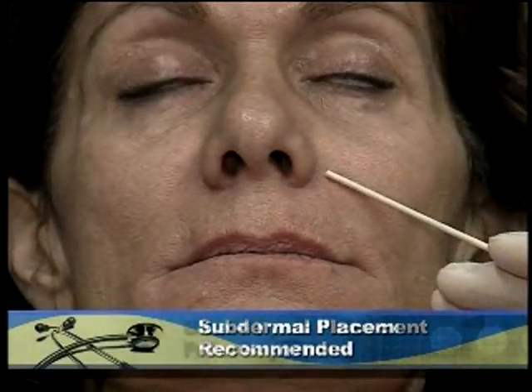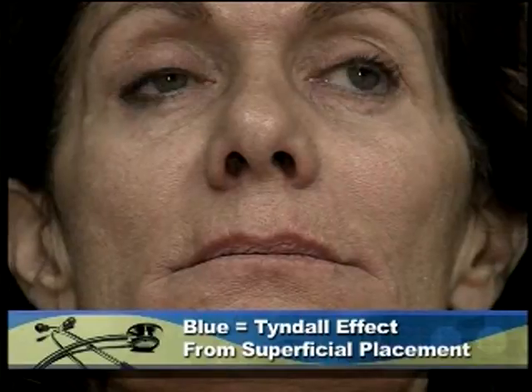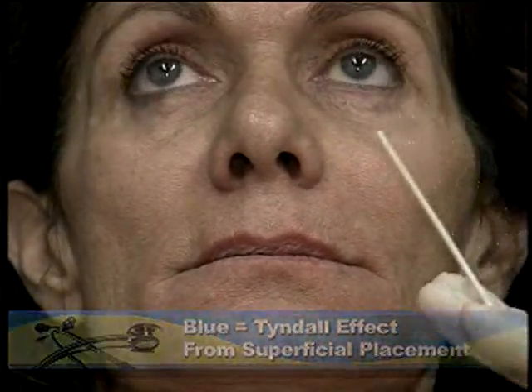By doing that, I believe it raises the whole fold up, and it's a much more natural result. I also believe that it's important to go deeper. I prefer to place it into the subdermis. Some doctors recommend placing it into the dermis. I feel that the results are better if I place it in the subdermis because you get a more natural result and you avoid getting a little blue line, which sometimes can be seen if the hyaluronic is placed too superficially. So I place it a little bit deeper to the fold. I raise the whole fold up using a fanning technique, but it does require more product.